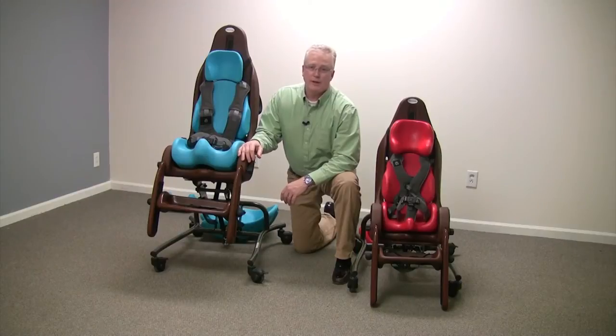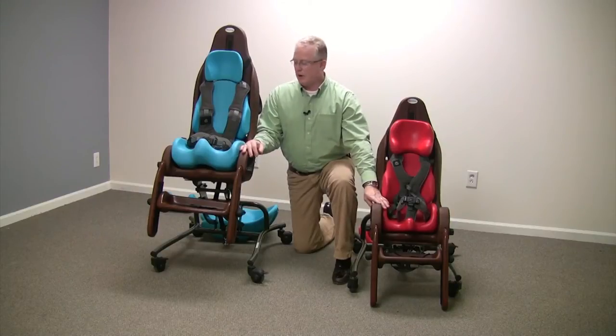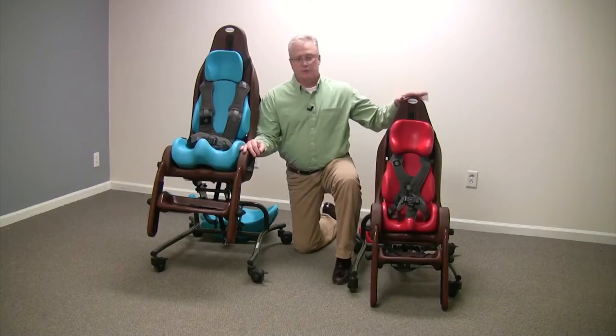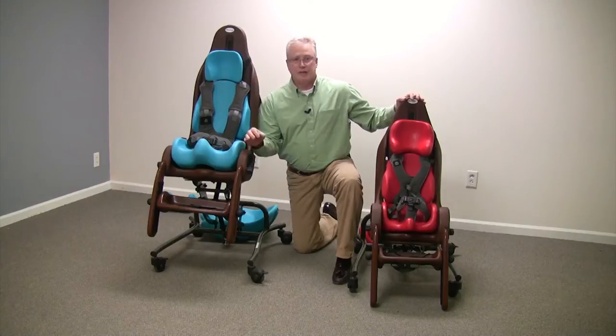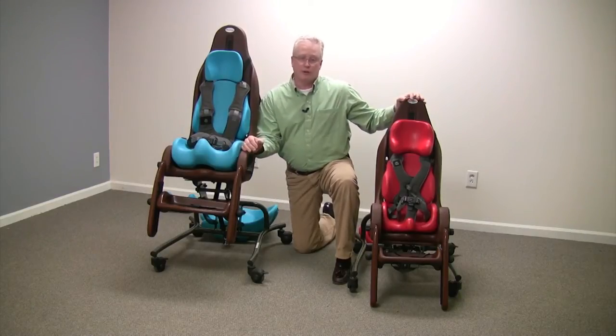Today we're going to be discussing the Special Tomato High-Low MPS seating system — the small seating system and the large high-low seating system. The small has a weight capacity of up to 80 pounds, and the large has a weight capacity of up to 130 pounds.